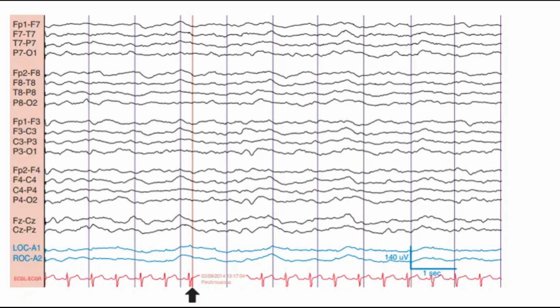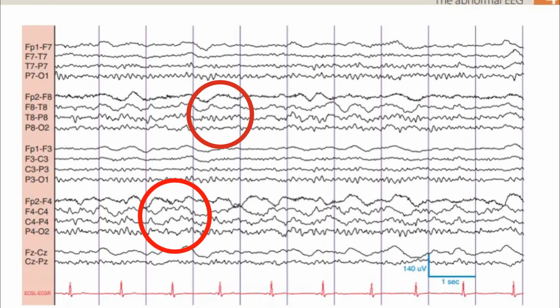It's good to know. So it's not just the rhythms themselves, but also the context. Like focal delta activity, that would be delta waves just in one specific area of the brain, concentrated in one area. And that could be a sign of something called localized brain disease. It's fascinating how we can tell so much just from these brainwave patterns, these little squiggles. Amazing.